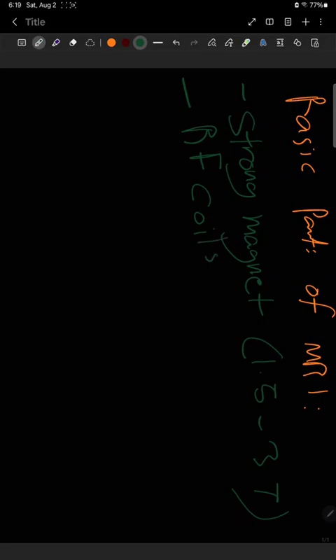We already just explained the function of it. It actually sends and receives radio signals. Of course, we need the computer system to actually analyze the image and make the final map.